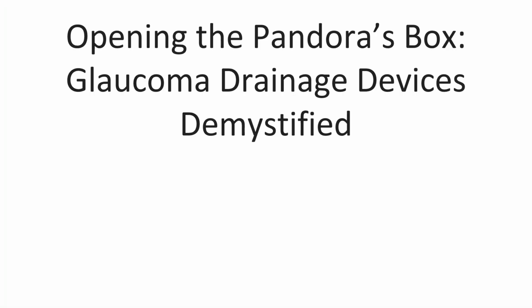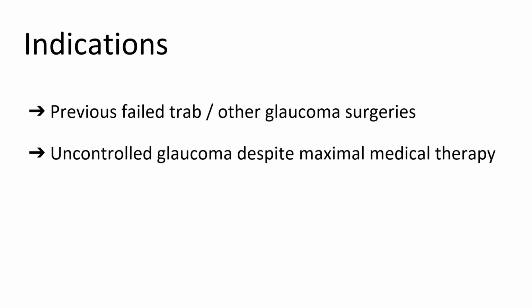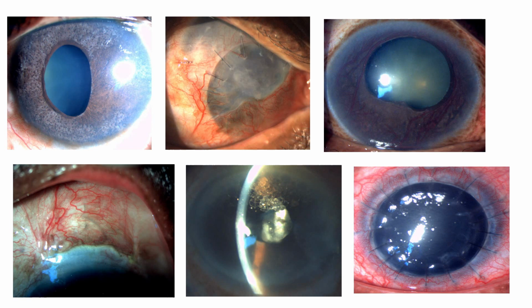This video will deconstruct and simplify glaucoma drainage device implantation. Though trabeculectomy is still the gold standard procedure, glaucoma drainage devices have certain clear irreplaceable indications like ICE syndrome, glaucoma after chemical injury, corneal and vitreoretinal surgeries, failed trab and neovascular glaucoma.